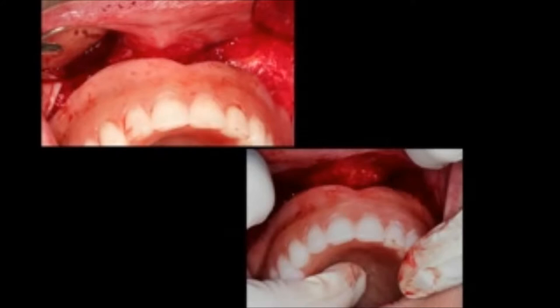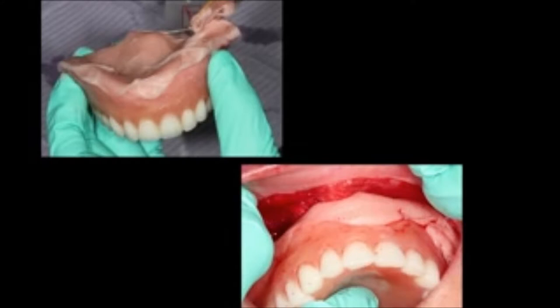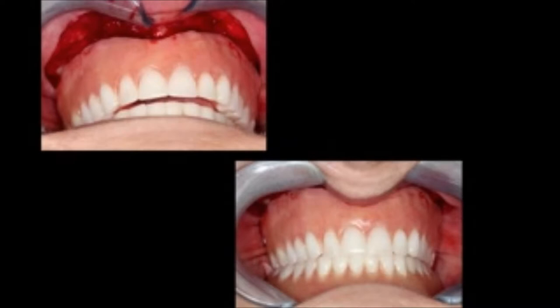We're now trying in the denture, and you'll see the denture will fit. If necessary you can do some touch-up surgery in an area where it might be binding, but as said earlier we're going from hamular notch to hamular notch. On the left we see the treatment denture or stent. To assure a better fit, we're going to use a soft liner — in this case COSOFT. It's now being tried in, the denture has a certain amount of suction, and the patient already begins to sense what we're able to accomplish. The yellow area points to where the nasal spine was removed — you can see the different contour, and the flange goes much further up, adding to the retention of the denture. Here it is in place — no longer a Sunday denture.